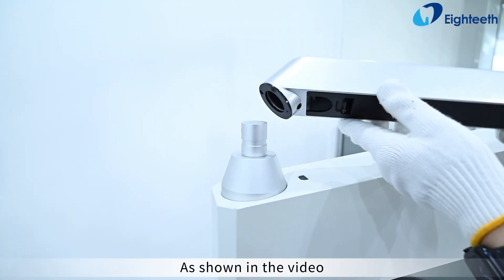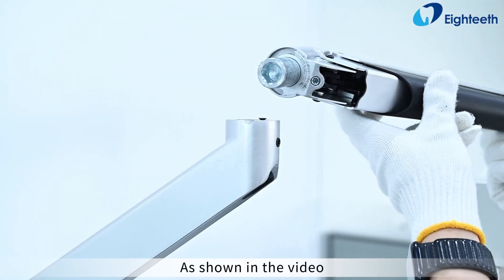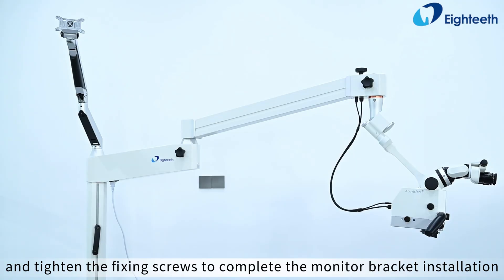As shown in the video, install the lower arm of the monitor bracket and tighten the fixing screws. Then install the upper arm of the monitor bracket and tighten the fixing screws to complete the monitor bracket installation.